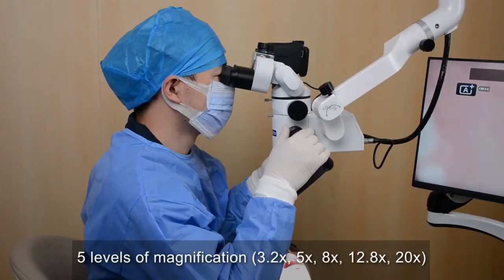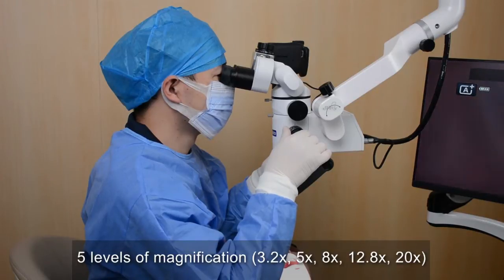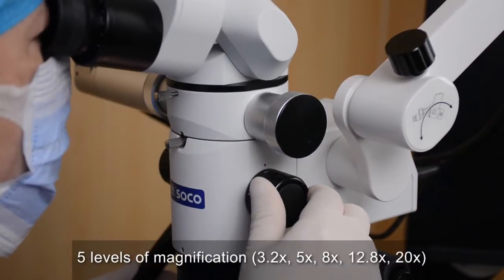Five levels of magnification: 3.2, 5, 8, 12.8, and 20.